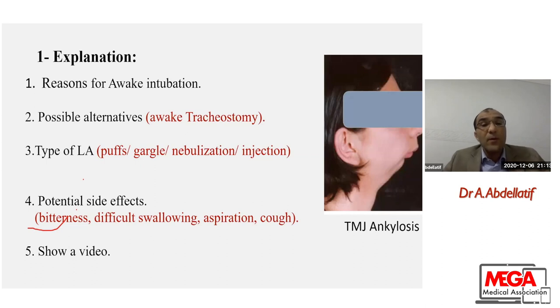And I have to explain to him that we will use local anesthetics as puffs, as gargle, as nebulization, or injection. Whatever the technique I will use, I have to let him know. And what potential side effects he will feel, like bitterness of the local anesthetic. Lidocaine is very bitter. He will feel difficulty swallowing. He may feel aspiration. He might cough.